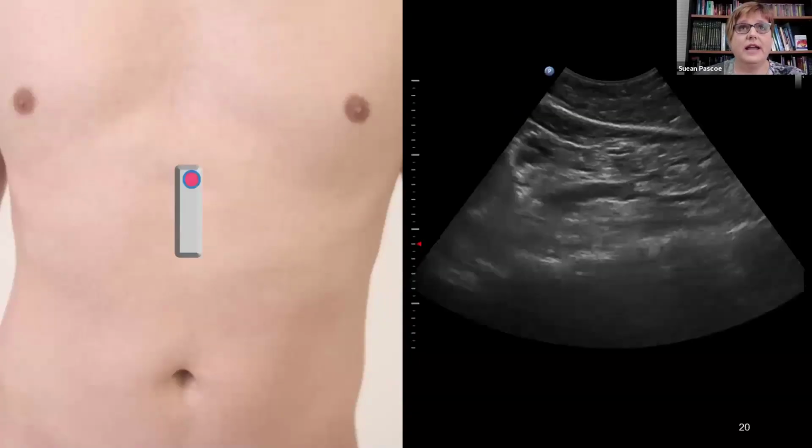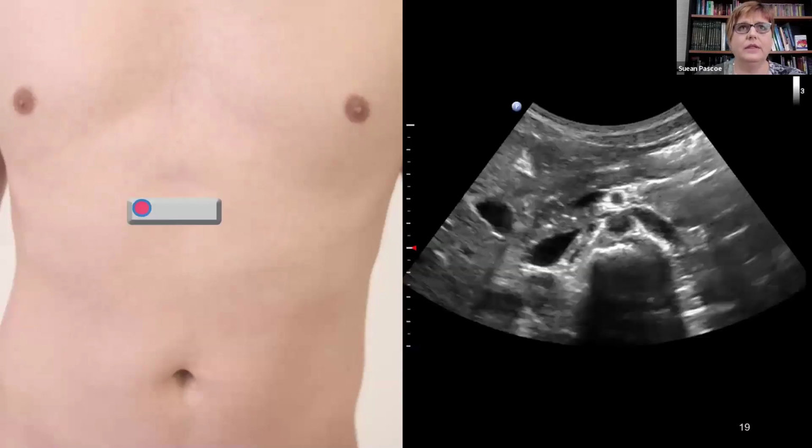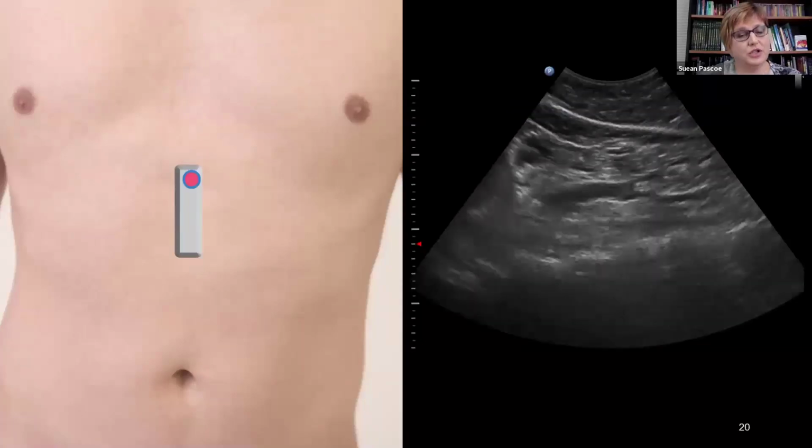You can use both the transverse and the sagittal plane. So, oh, hang on, I think we've missed one here. So we can use the longitudinal plane as well. And what you'll find here is that you need to be slightly right of midline. And again, we're looking for that vascular landmark of the splenic vein to help outline this. So the pancreas is around in this manner here.